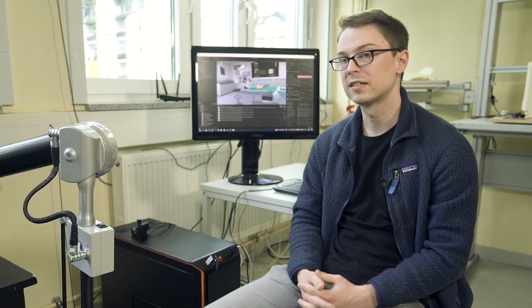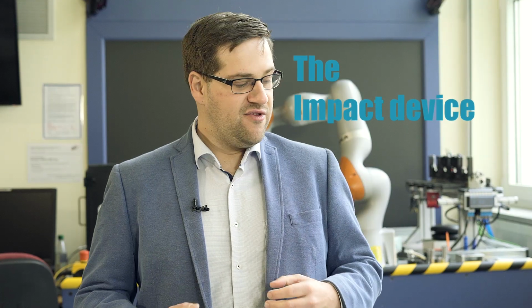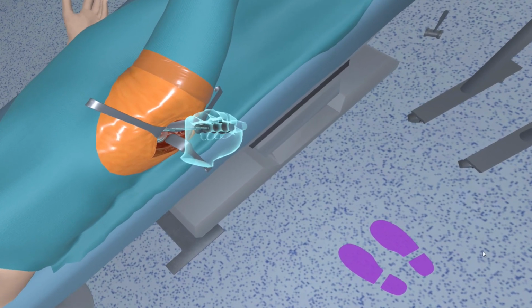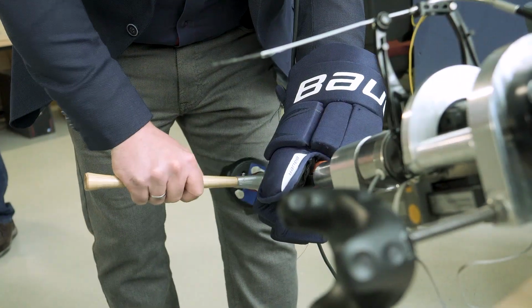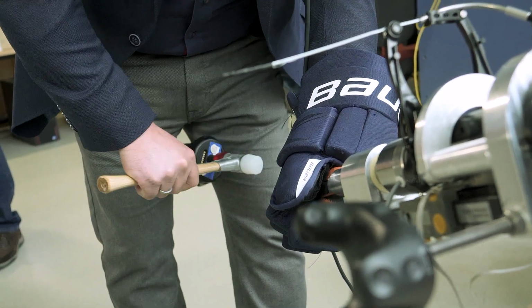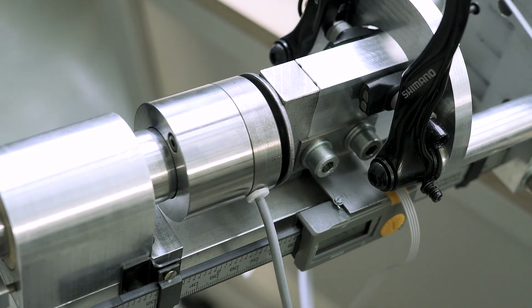We place very high expectations on haptics in terms of performance, accuracy, stability. And during the impact steps especially, we've noticed that high peak forces of up to 20 kilonewtons occur in the impulses. These are, of course, very high forces, which meant that we had to develop a special device, this impact device, which on the one hand allows these forces to be absorbed, but at the same time also enables movement. Because during these steps in reality, of course, the instruments also move in the direction of the impact.